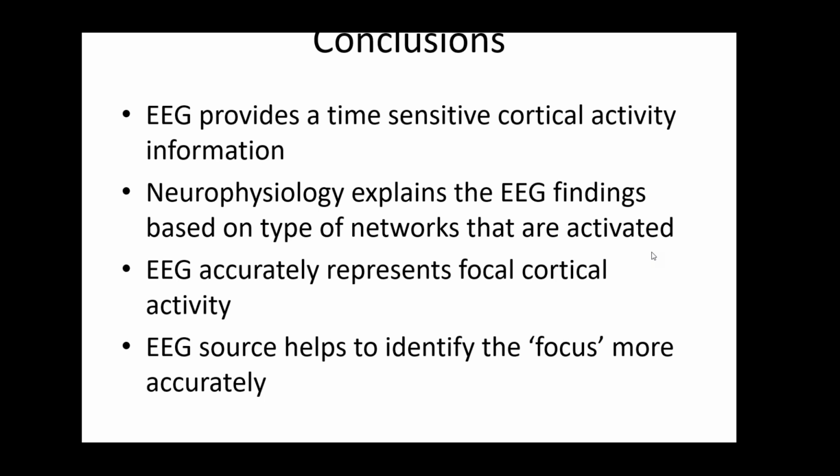But in the EEG, you will not be able to see that. You only see the spiking. You see too many spikes in one area. That means that area has changed microcircuitry.